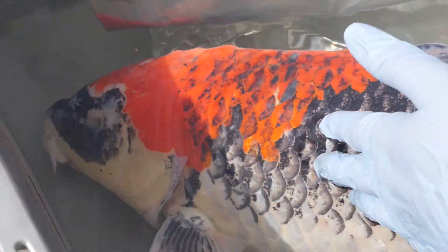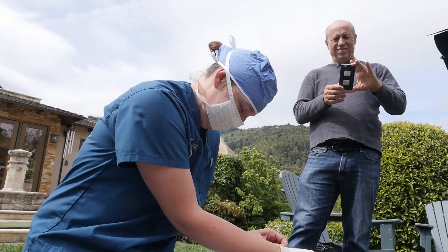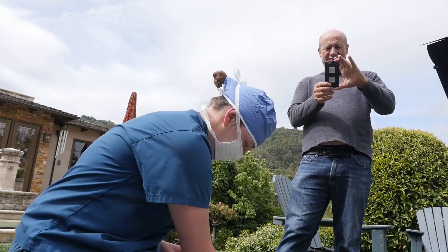How neat is it to have the surgery performed right at your pond? Oh, it's great. Jessie's great. We couldn't beat this, I'll tell you what. Thank God we found her, because these fish are my wife's life.